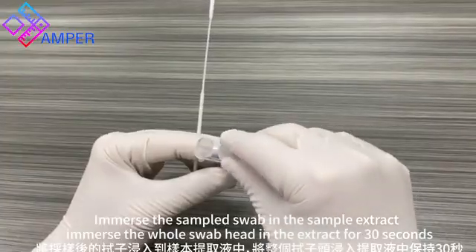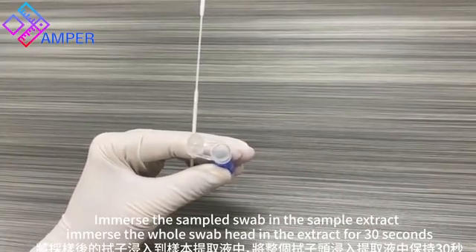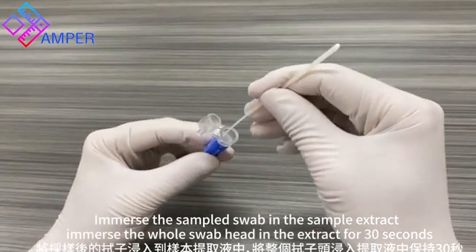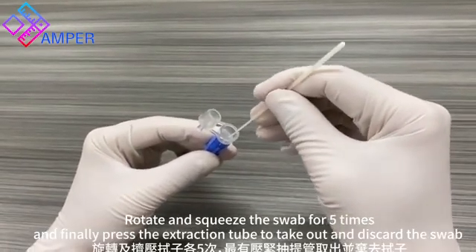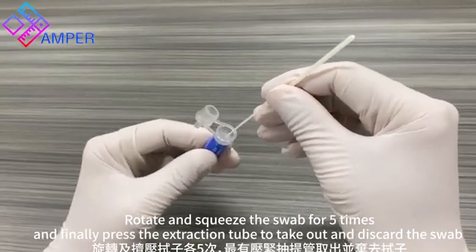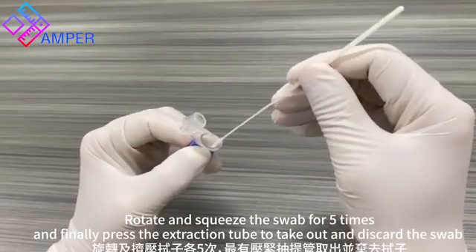Immerse the sampled swab in the sample extract. Immerse the whole swab head in the extract for 30 seconds, then rotate and squeeze the swab 4 or 5 times. Finally, press the extraction tube to take out and discard the swab.